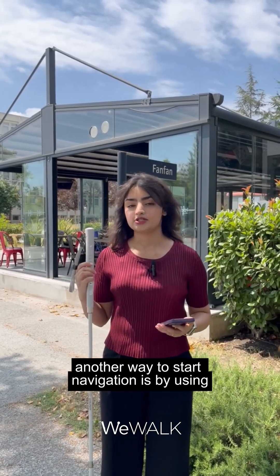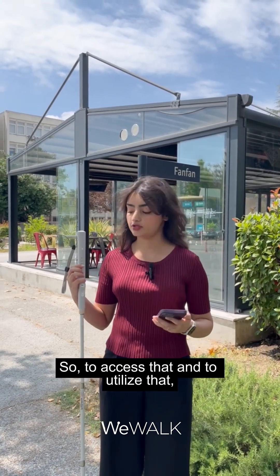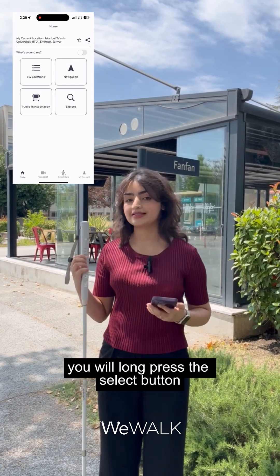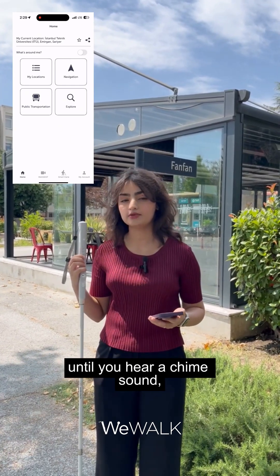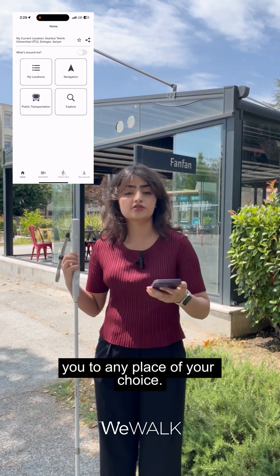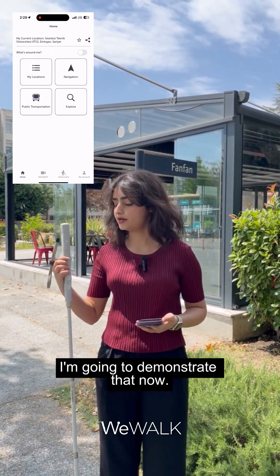Another way to start navigation is by using the voice assistant feature. To access it, you will long press the select button until you hear a chime sound. Once you hear that sound, you can ask it to navigate you to any place of your choice and it's going to start the turn-by-turn navigation accordingly. I'm going to demonstrate that now.